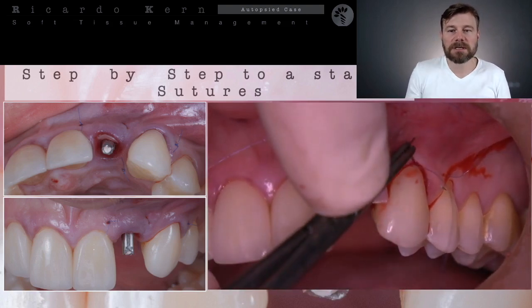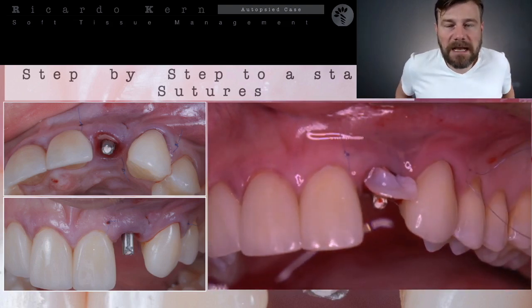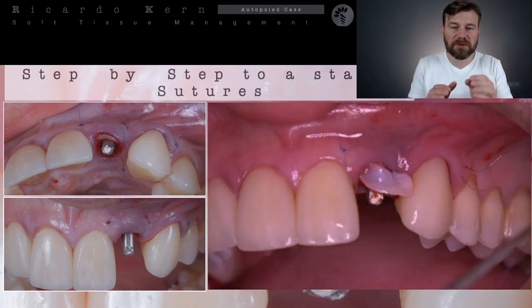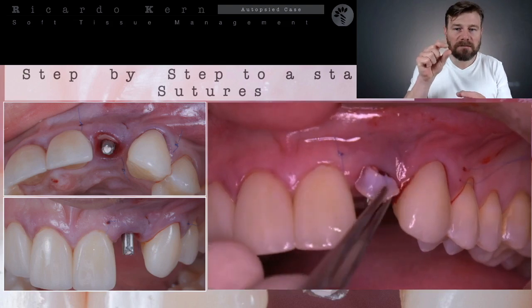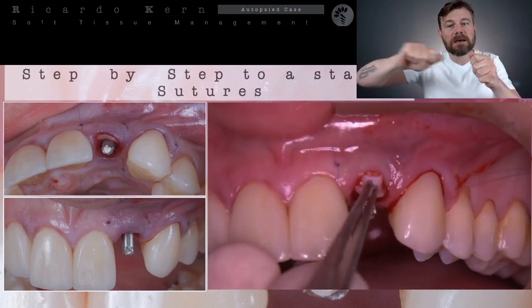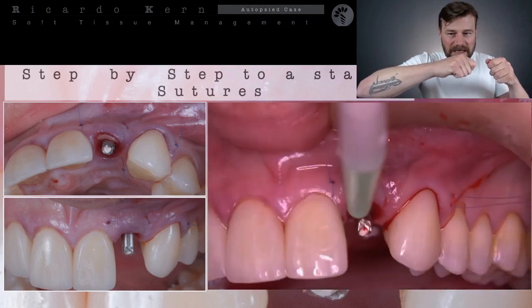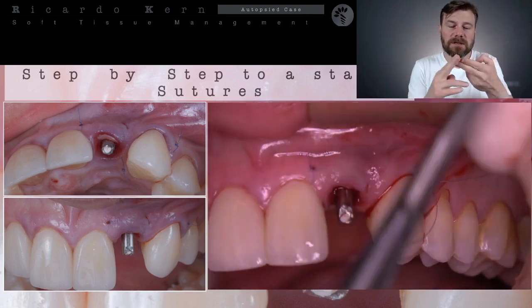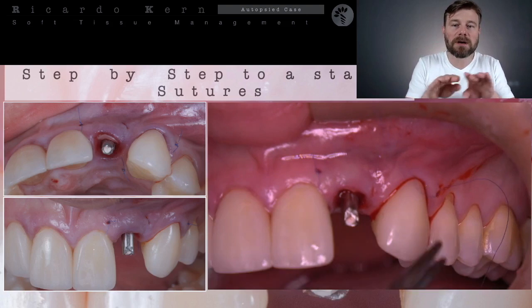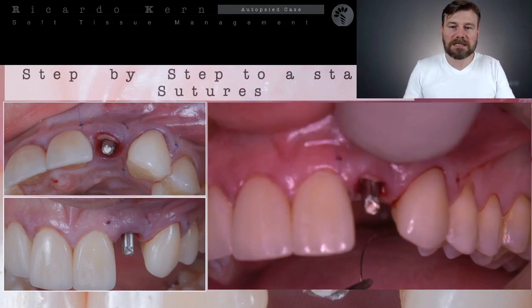And once more, returning to the anchorage point, what I need to do is bring the connective tissue inside the tunneling area. To help you to do this movement, you can use a microplier or another instrument, and hold the border of the connective tissue you took in the middle of the tunneling area before you start to drag the sutures to the lateral side. Why is that? Because if you start at the beginning to drag the sutures, sometimes the connective tissue is stuck on the corner of the sulcus that you prepared for this tunneling area, and tie a lateral knot.